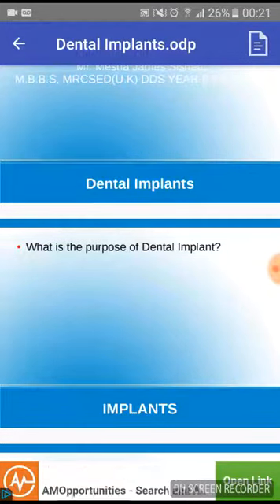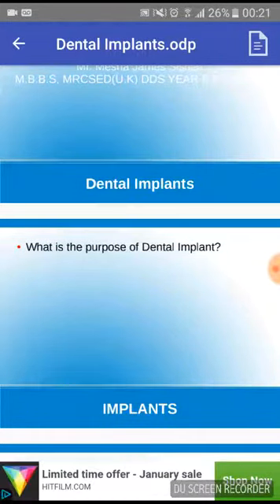Now, like I mentioned before, one of the things we want to ensure is that the implant bonds with the bone. The upper and lower jaw take different amounts of time to bond with the implant. The lower jaw bonds usually take about 3 to 4 months to occur around the implant, while in the upper jaw, bonds usually take about 5 to 6 months. So remember, the lower jaw is able to form a bond quicker with the implant than the upper jaw. That represents the time in which you bring the patient back to do the second procedure.